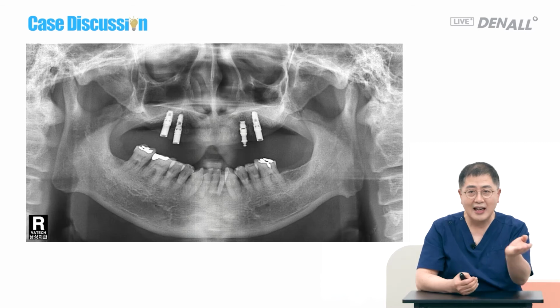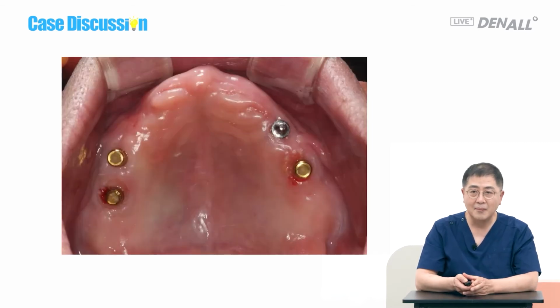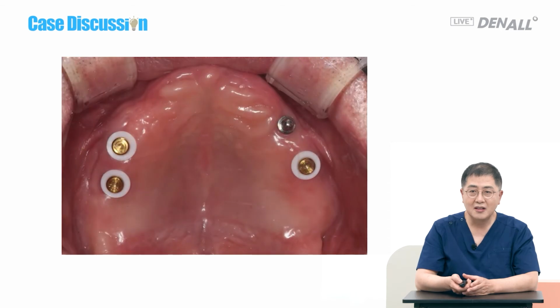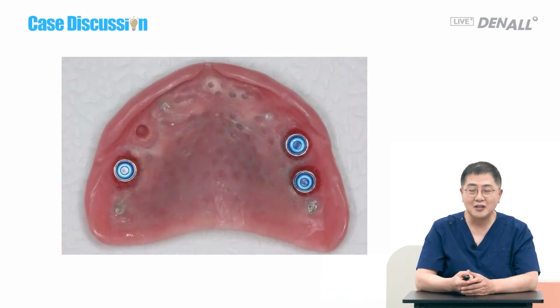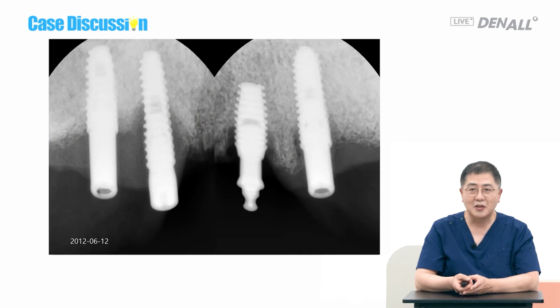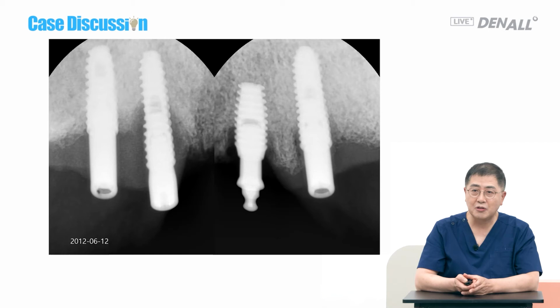Here, mandible teeth exist, and an overdenture was done on the maxilla. 3 locators were attached to the implants, and I was very happy when I took this picture. It was my very first case, and I thought the patient would use it very well. But the implants with locators failed, so I placed implants again and attached the locators.